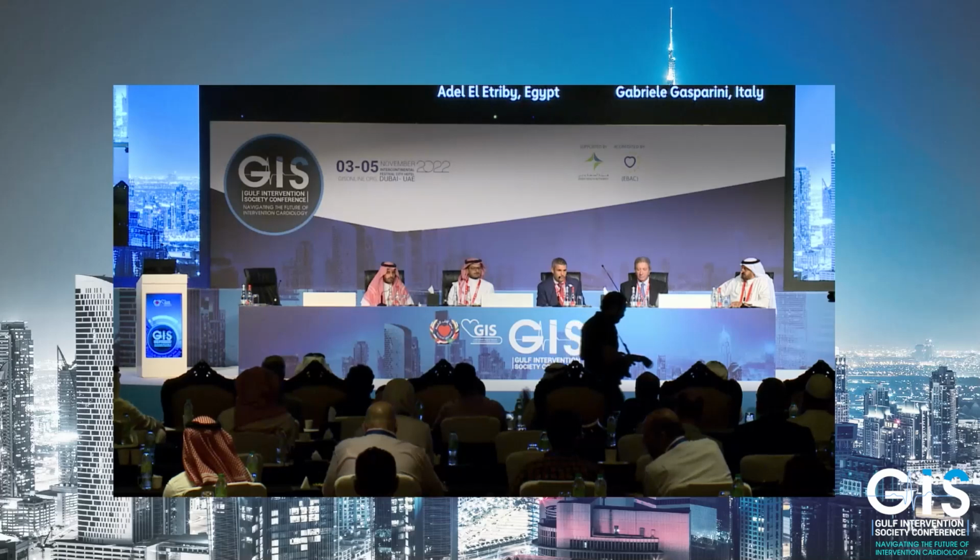I think this is one of the most important aspects that we should consider before doing that. Not only just to assess the severity of the lesion, measuring the area, but also having an assessment of the bifurcation involvement. So when you have to deal with left main intervention, we should always consider use of imaging.